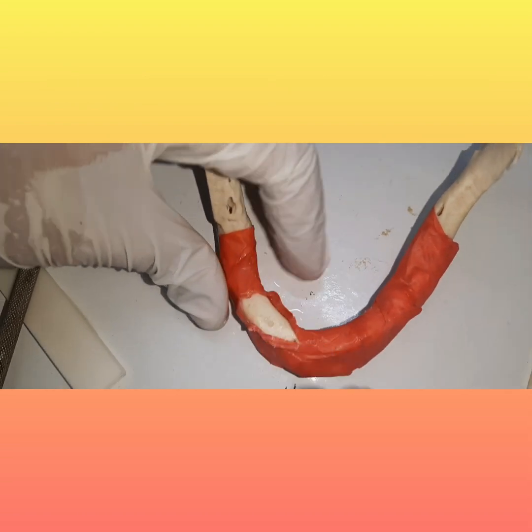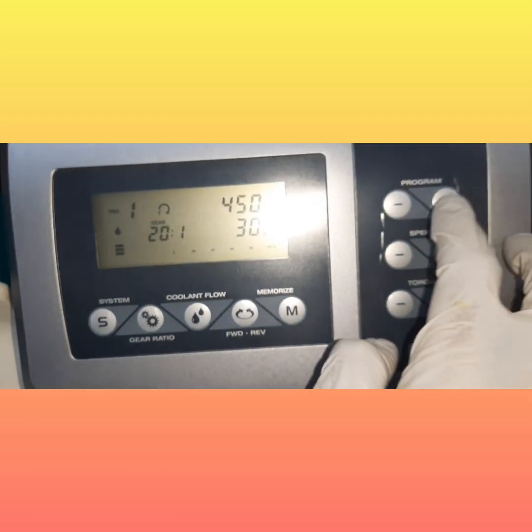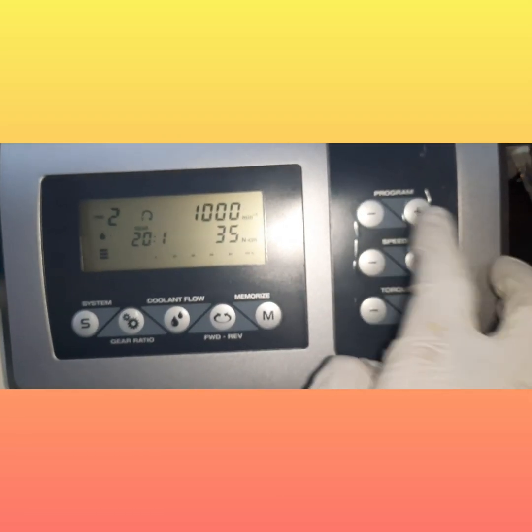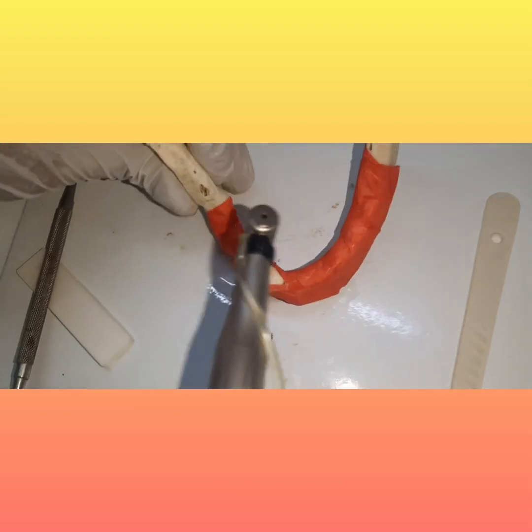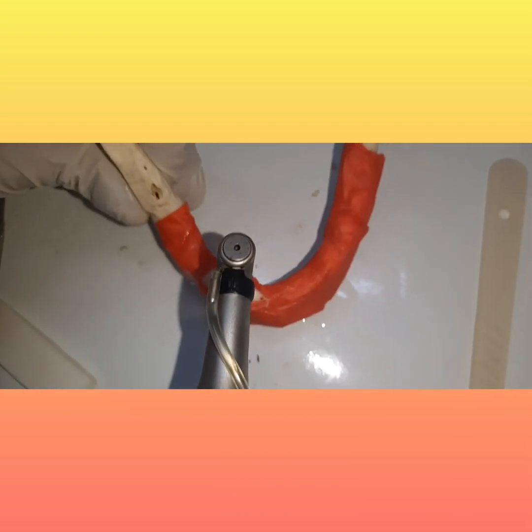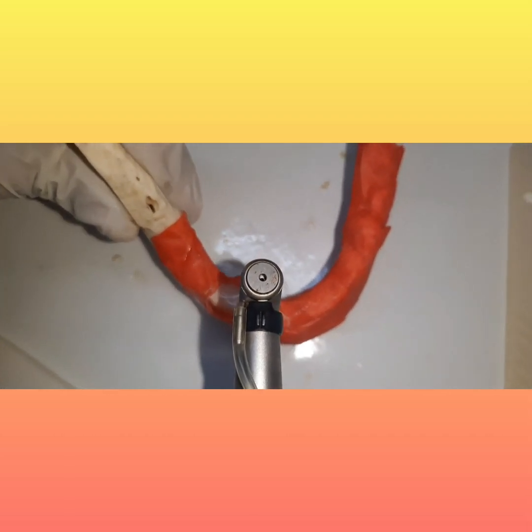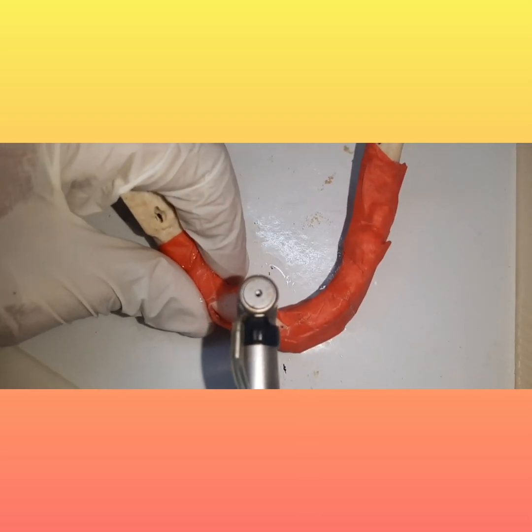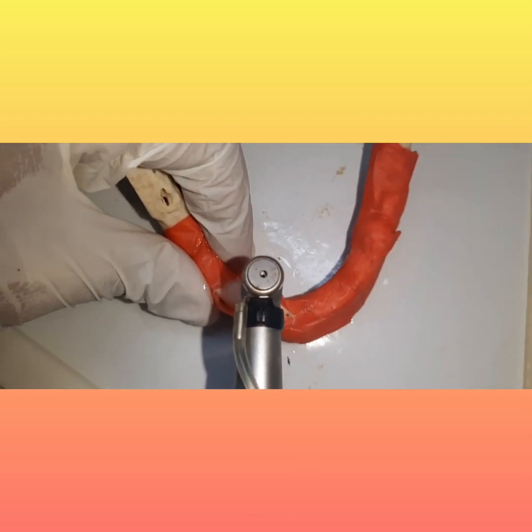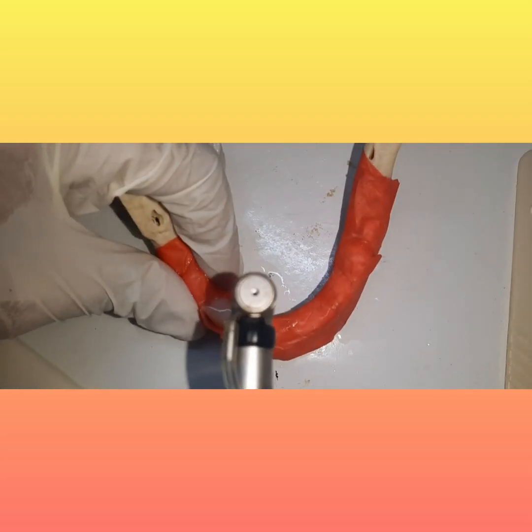You can increase the speed if you want. And then you can go. Always stabilize. It depends on the speed which you want to use, and on how much density of bone is there.